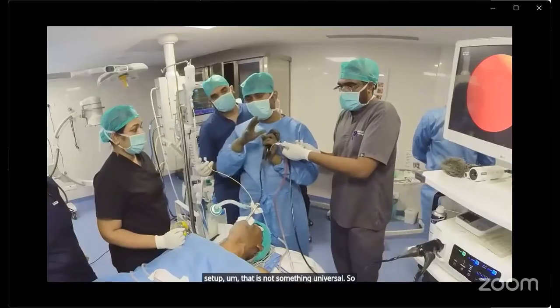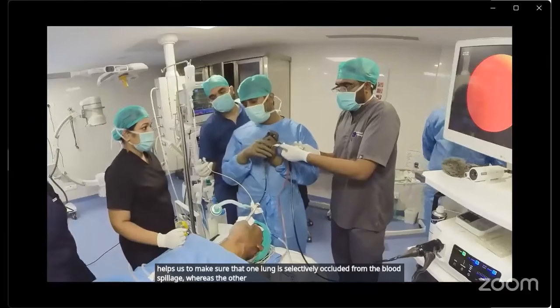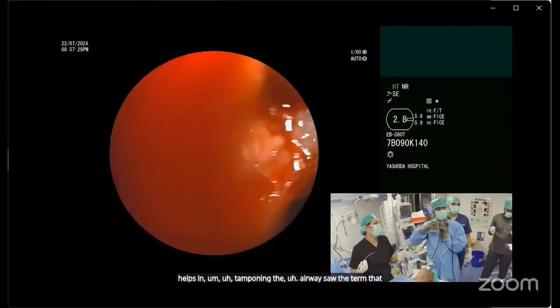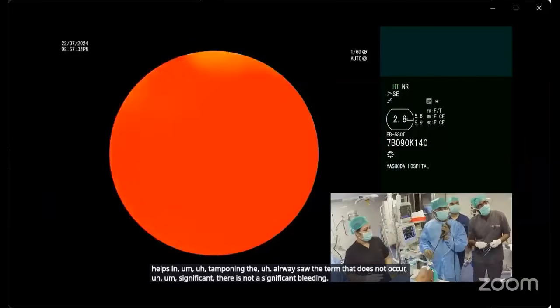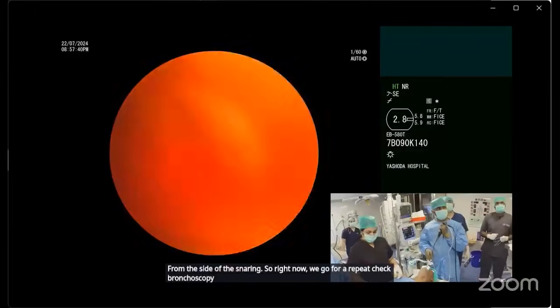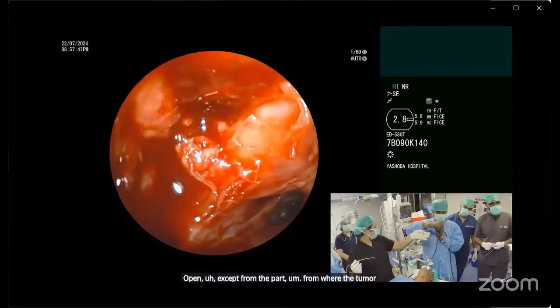So this double Fogarty technique helps us to make sure that one lung is selectively occluded from the blood spillage, whereas the other Fogarty through the working channel helps in tamponating the airway, so that there is not a significant bleeding from the site of the snaring. So right now we go for a repeat check bronchoscopy, and you can see that the airways are pretty much open, except from the part from where the tumor is actually occurring.